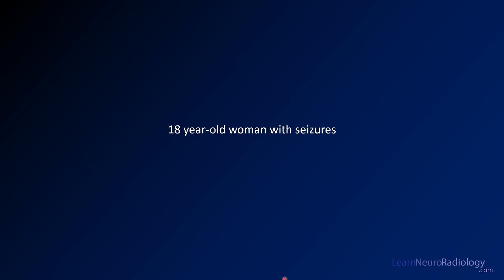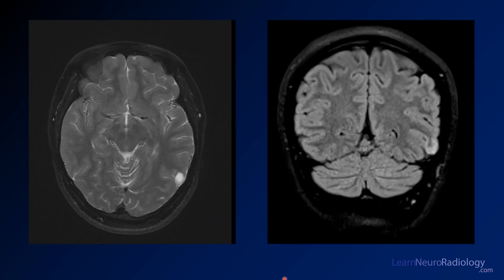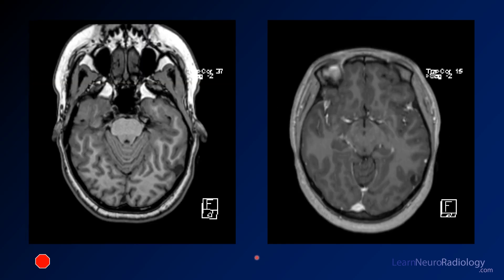For our second case, we have an 18-year-old woman with seizure. On the left, we have a T2-weighted image showing a well-marginated lesion in the left posterior temporal cortex — very bright on T2. On FLAIR, it's quite difficult to appreciate; you see somewhat ill-defined cortex in the posterior temporal lobe. On pre-contrast imaging, there's a T1 hypointense mass along the cortex, with maybe a thin linear bit of enhancement versus a small vessel.